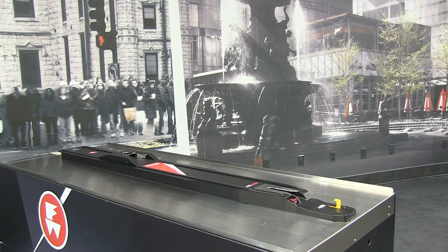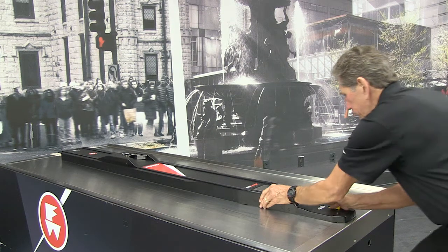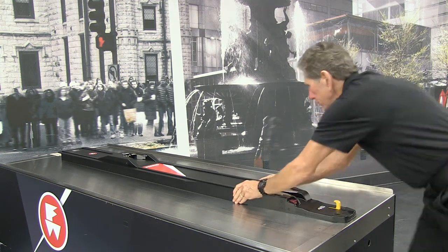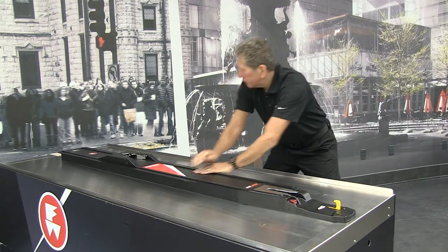Check both ends of the fastening system for any looseness or wobble. Using both hands, grasp the fastening system near one end and attempt to rock it side to side. If there is any noticeable movement, adjust the installation. Repeat this check at the opposite end of the fastening system.